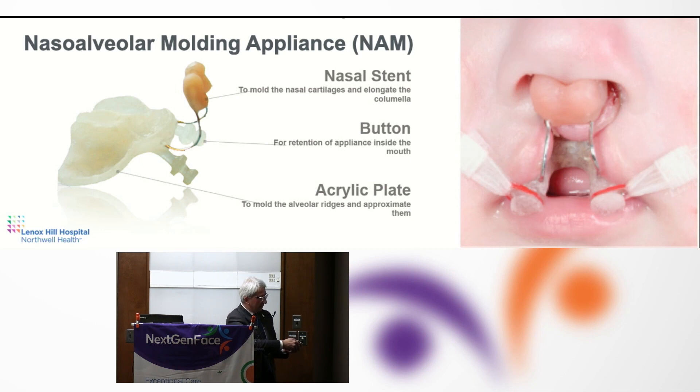This is an example of a naso-alveolar molding appliance. There's an oral component and there's a nasal component. The oral segment is bringing the cleft alveolar segments together while the nasal component is expanding inside the nose.